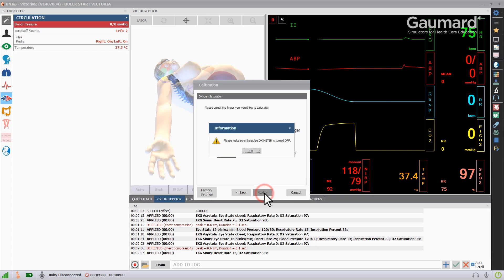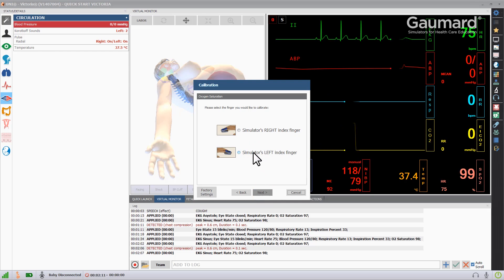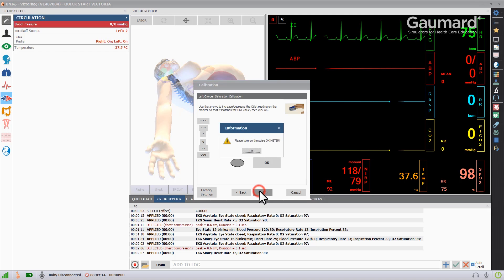Place the oximeter on the left index finger of Victoria and turn it off. Then click OK in the calibration window. Click Simulator's left index finger and click Next.